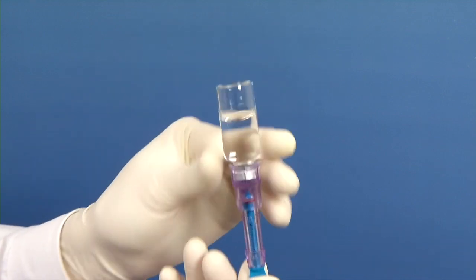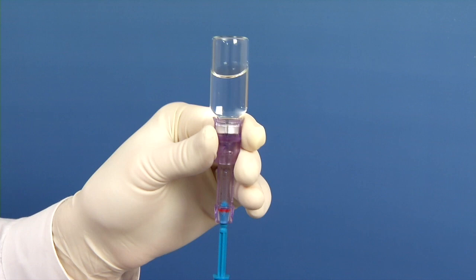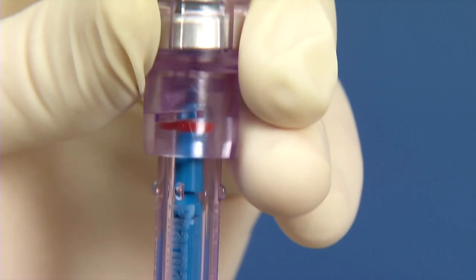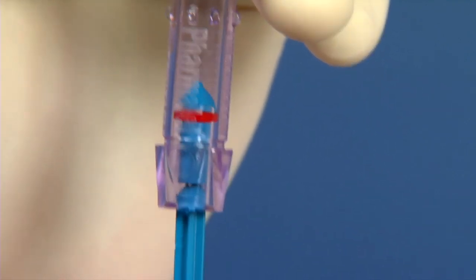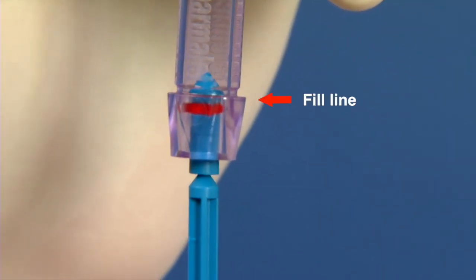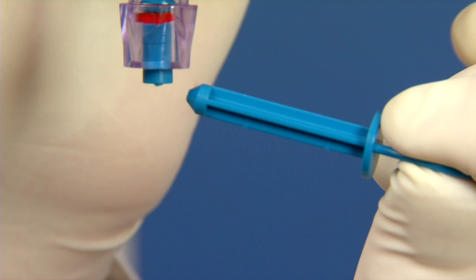Invert the assembly and pull down on the syringe plunger to draw fluid into the syringe, removing air bubbles as required. Draw down the plunger to the point where the red O-ring is slightly beyond the fill line. The 0.5 milliliter fill volume is automatically set when the syringe is inserted into the injector, so a slight overfill at this step is preferable. While keeping the entire assembly inverted in your hand, snap off the end of the plunger at the neck with a bending, not twisting motion, and discard.